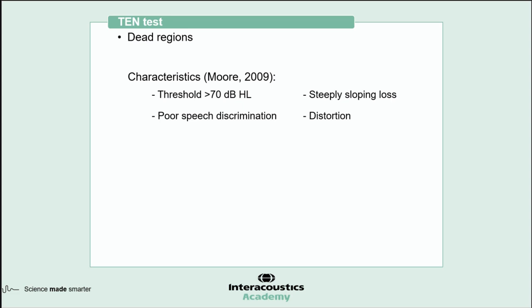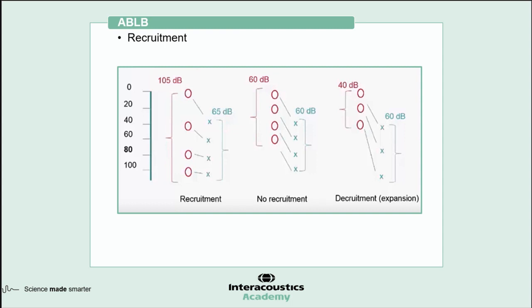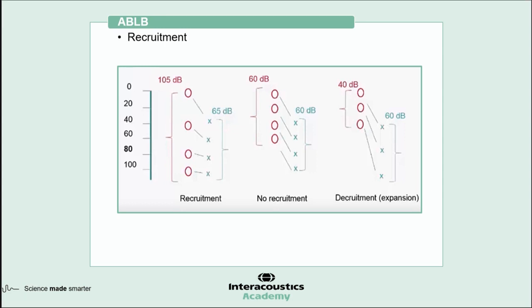And we've got a final question before we close our webinar for today, that's coming again from the USA, from Sherman. His question is, since many audiologists are pressed for time, with respect to your discussion about recruitment testing using the ABLB, wouldn't we establish the presence of recruitment by measuring accurate UCLs? Absolutely. I think the ABLB is useful for asymmetrical losses. So you need to have an asymmetry to use that. If you've got a bilateral loss, it's not appropriate in those indications.